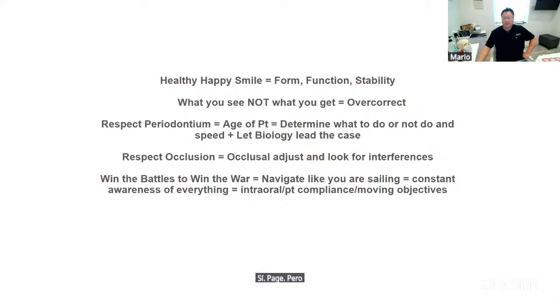Everything is very individualized. There's no one formula, not even one general formula. Everybody is so individualized. We learn all the tools, we have all the toolboxes, we have to use the tools, and sometimes use one tool for something else. So we have to really be outside the box, inside the box, and really ask and learn and constantly navigate, right?